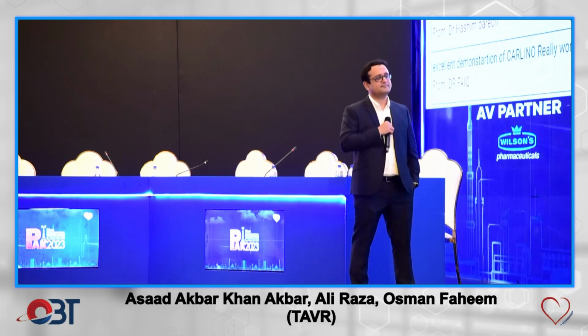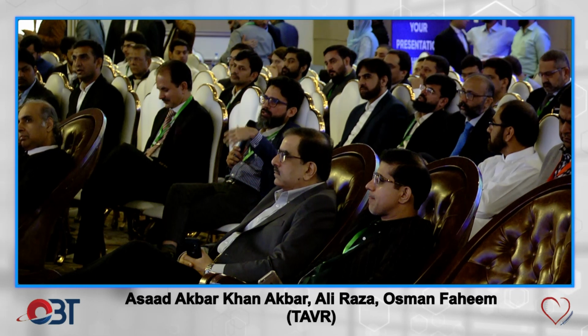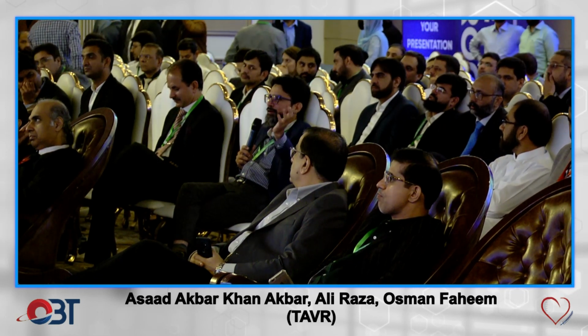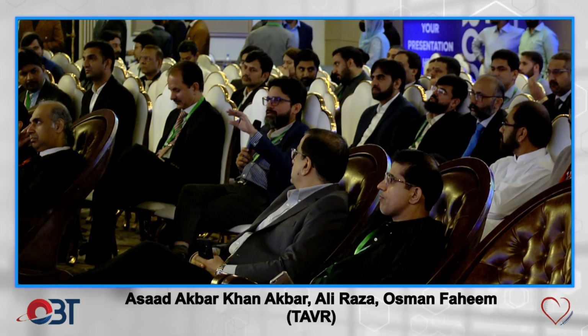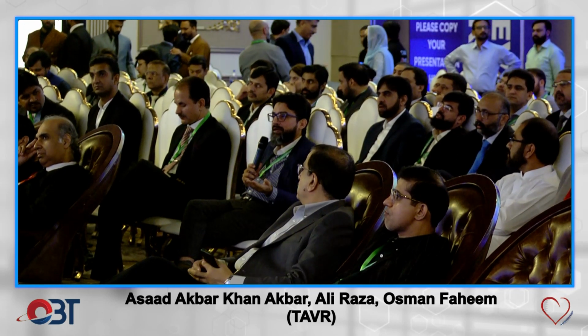See, one thing, especially if you're putting in large frames, it's very important to do a 360 sweep. I go RAO caudal to LAO caudal, RAO cranial to LAO cranial, just to see there's no enfolding. Because understand, enfolding, for bicuspids, yes, that could be the nidus where all the PVL is coming out of.